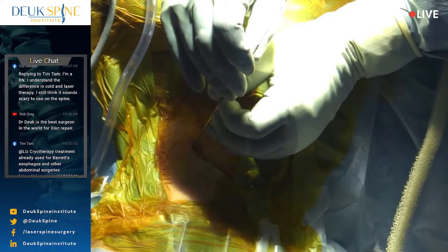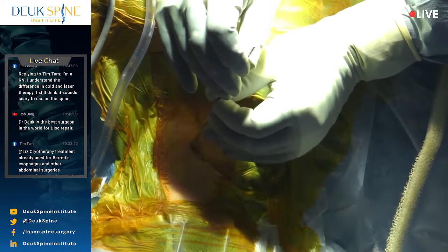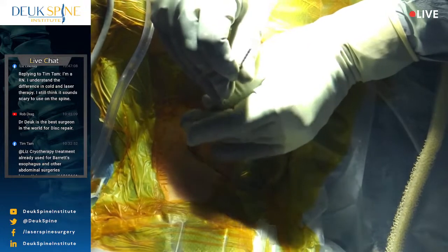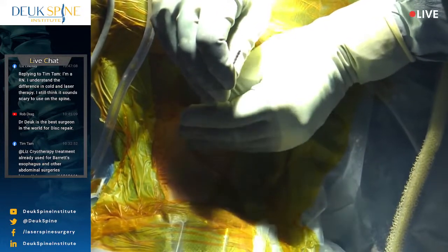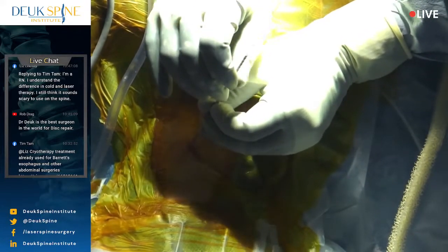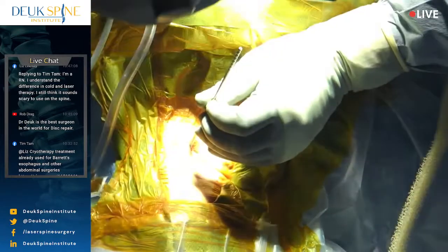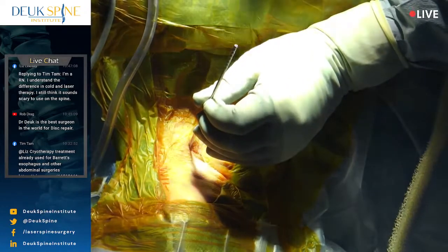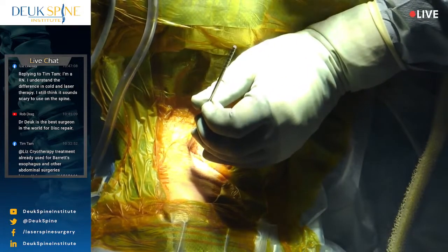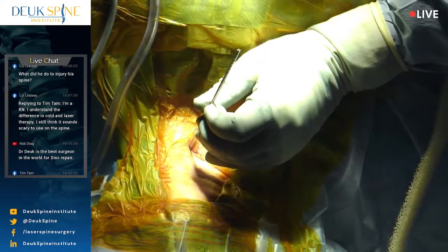Everyone agrees. C2, C3, C4, C5, C6, C7. So we have verified about 10 times, which is always what I recommend every spine surgeon do. I'm a very experienced spine surgeon, and I verify 10 times. Why? Because you never want to operate on the wrong level, okay? And I never have. In 25 years of being a doctor, never. And it's because I take my time, I verify multiple times, and I get help from my staff.